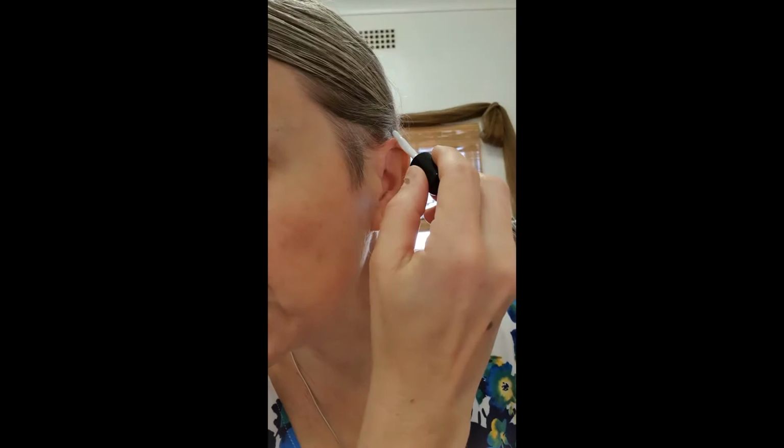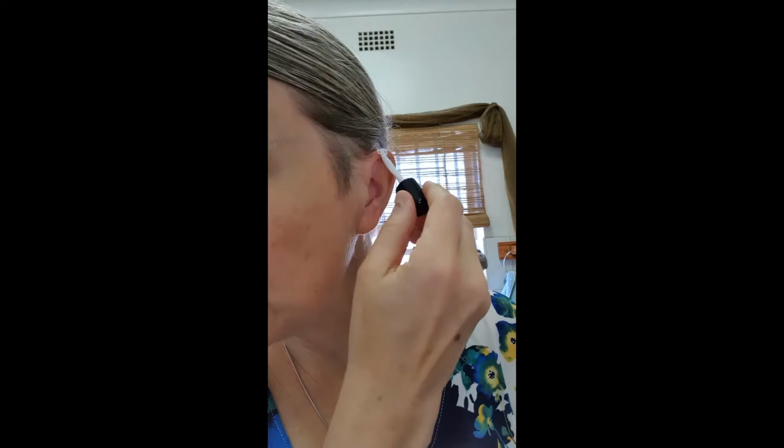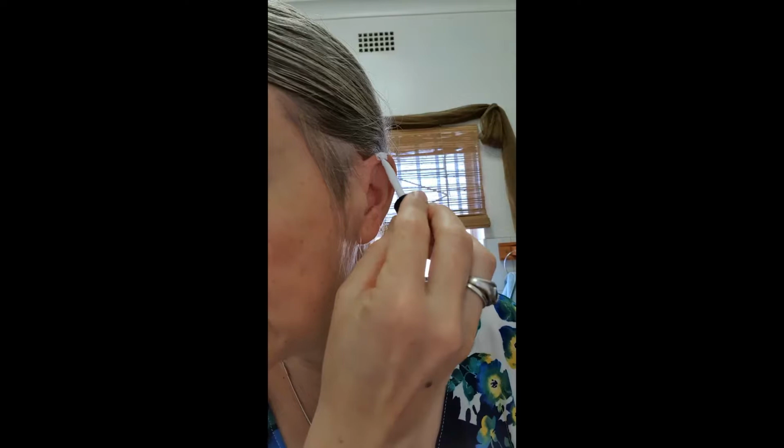So what we now do is start at the top and try to stay out of the way of the hair. I now need to fold and smooth that joint there quite nicely. You can see once again it is white. I'll have to make a different plan with this hair at some stage. It is now really growing out and starting to cause major havoc. This is actually quite thick and way thicker than what you would use for an eyelash. And the idea is exactly to smooth that edge out. So it also helps, it holds the ear on better.